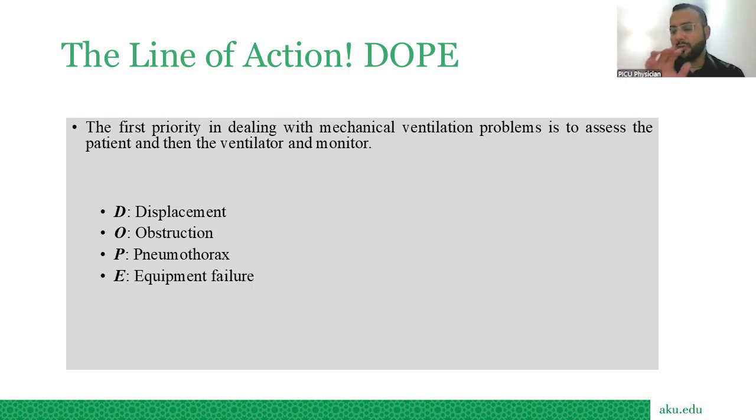Okay, so in all the cases, you must remember one line of action, that is DOPE. Whenever there is trouble in a patient who is being mechanically ventilated, you have to follow DOPE. All of the words, this is being followed.